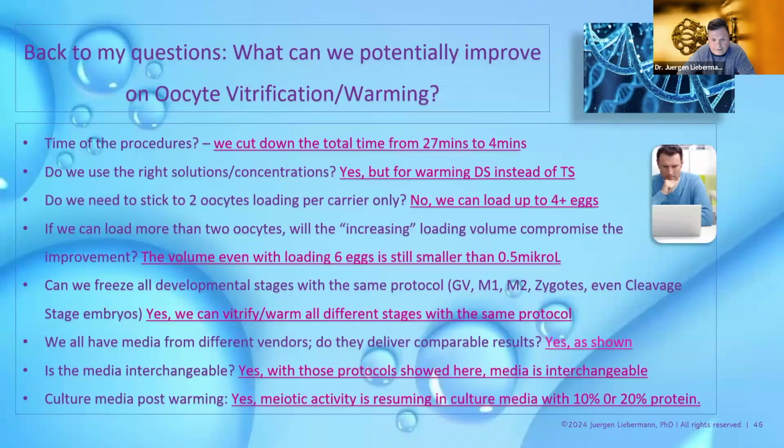Can we freeze all developmental stages with the same protocol? Yes, we can vitrify and warm all these stages with the same protocol. We all have media from different vendors. Do they deliver comparable results? Yes, as I showed you. Is the media interchangeable? Yes, with the protocols shown here, media are interchangeable.